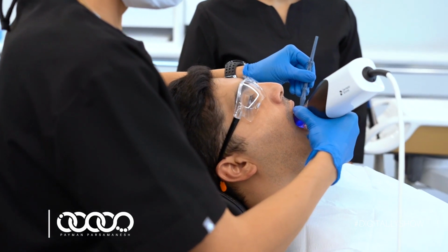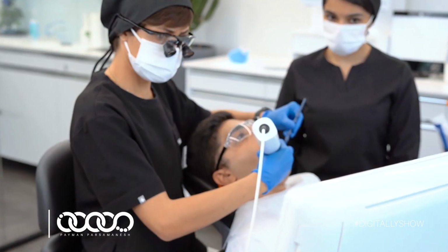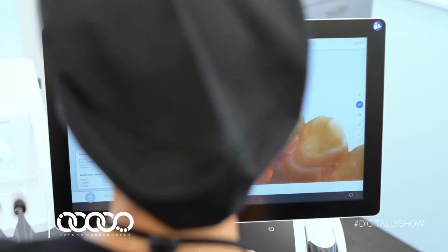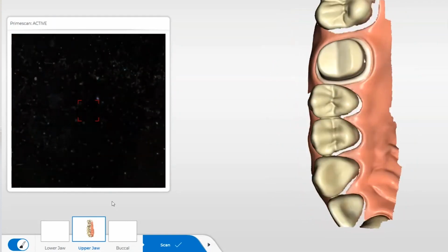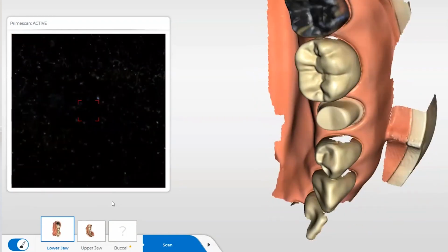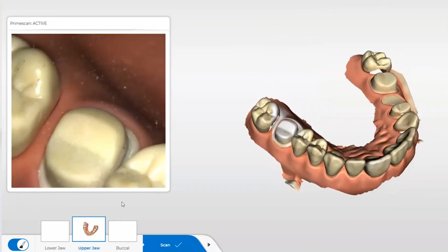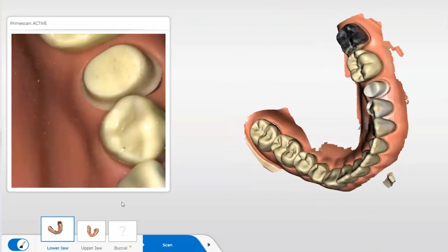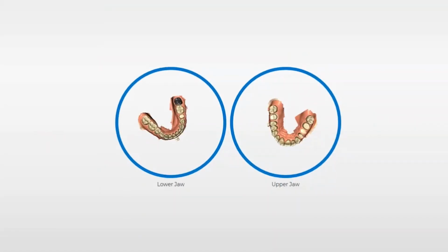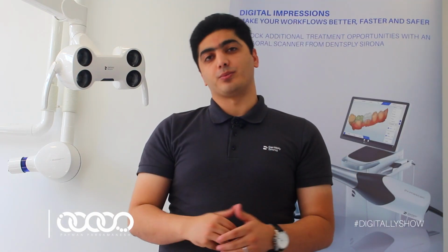Dentists can create a virtual computer-generated replica of teeth and tissues via digital impressions, which represent cutting-edge technology devices called intraoral scanners or IOS. The digital technology captures clear and highly accurate impression data in mere minutes, without the need for conventional impression materials that some patients find inconvenient and messy. The impression information will be transferred to a computer and used to create restorations, often without the need for stone models. So okay, what are the benefits of digital impression?